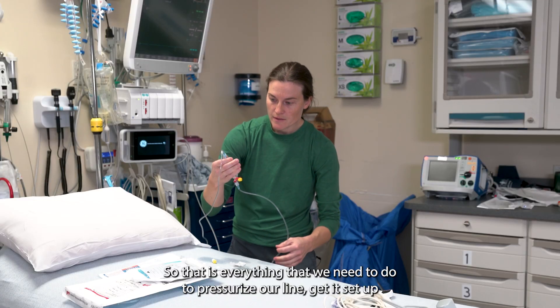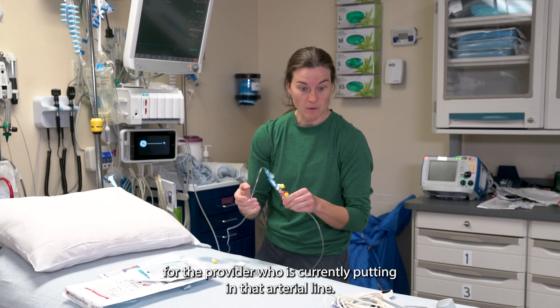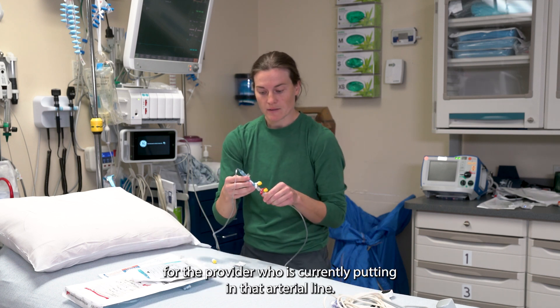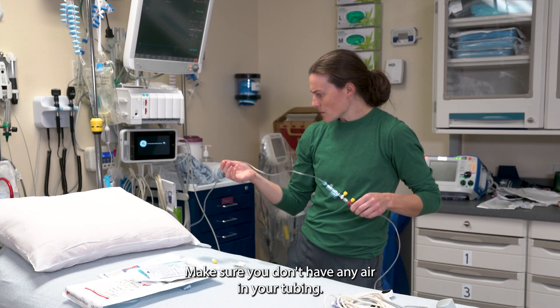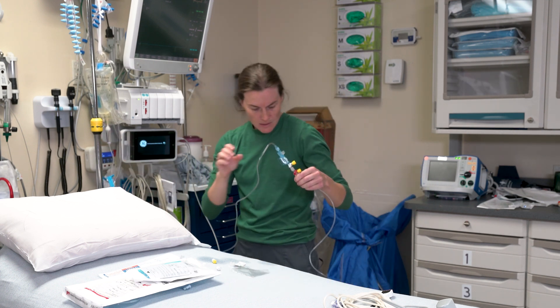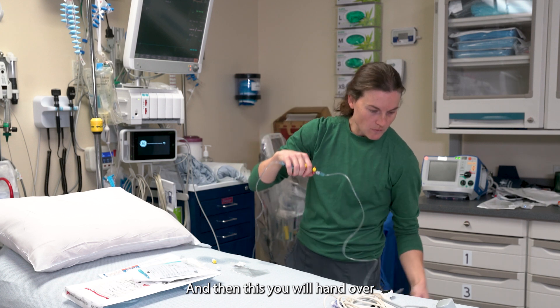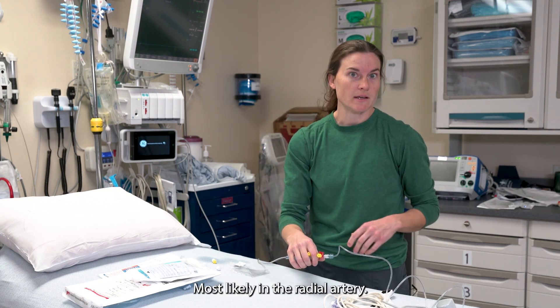That is everything that we need to do to pressurize our line and get it set up for the provider who is currently putting in that arterial line. Do one final check to make sure you don't have any air in your tubing, and then this you will hand over to get tied up to the art line, most likely in the radial artery.